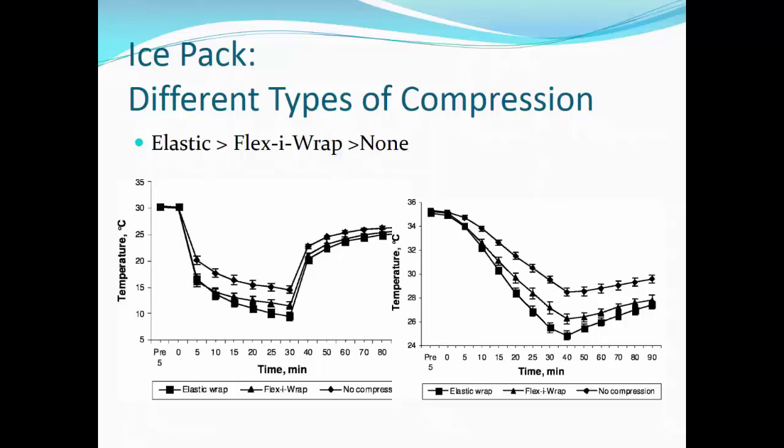However, many clinicians know that if an elastic wrap is issued to a patient, it will typically go home with the patient and then will not come back with them on their next visit, thus making elastic wraps an impractical and costly compression option for many patients.